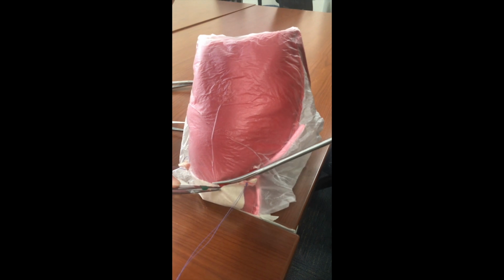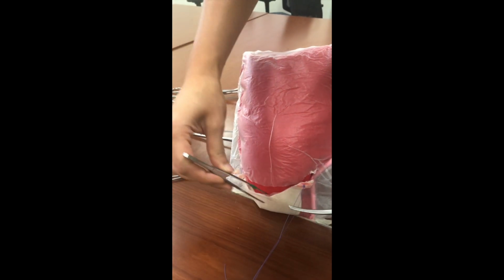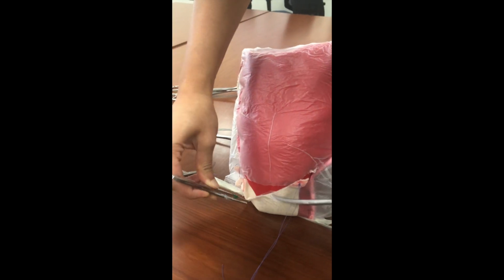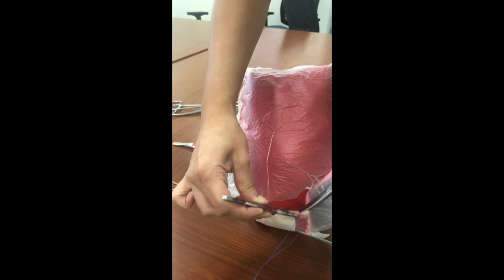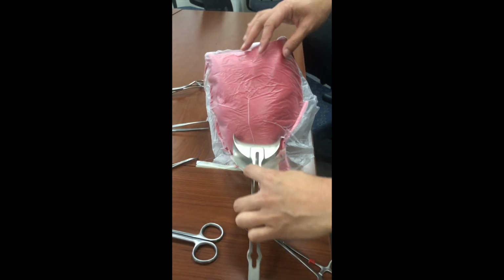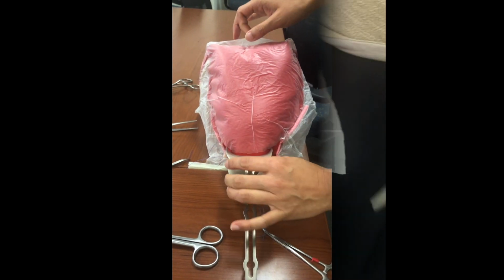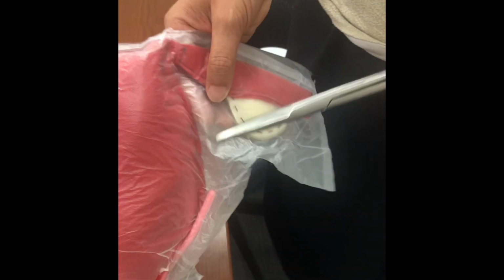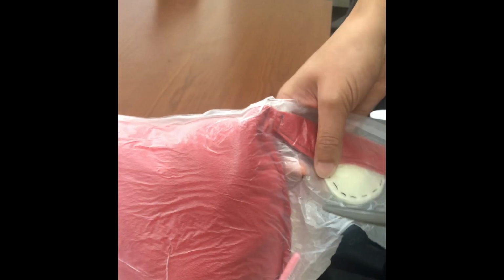Now, using pickups with teeth, separate down the uterovesical reflection. Now dissect down the bladder. You can now protect the bladder with a bladder blade. Now, using your finger, feel for a window in the broad ligament between the uteroovarian ligament and the uterus. Cut a 2 to 3 centimeter incision large enough to poke your finger through.